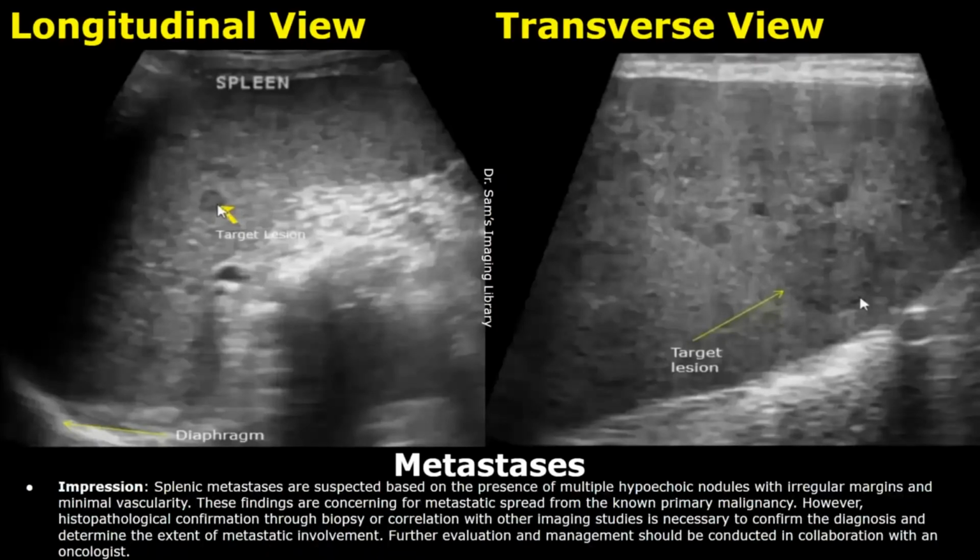In the impression, you can write the findings and also mention the history of primary malignancy, and you can advise biopsy and further evaluation with other imaging modalities and a referral to an oncologist.